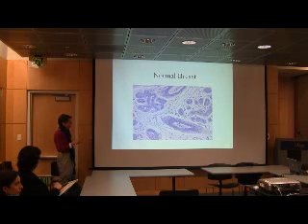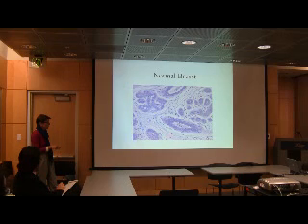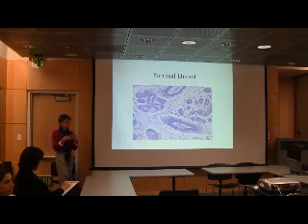Association with all lobular structures and often goes in between the small ductules as well. And these are fibroblasts, these are elongated nuclei. And in cancer, there's crosstalk between the stroma and the epithelial cells. And so you're familiar with that.